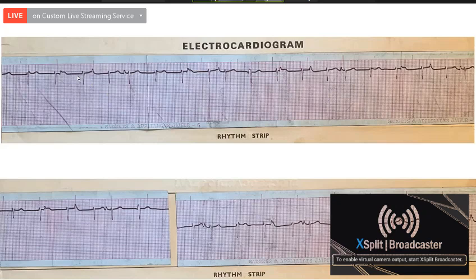The junctional rate is 80, 82. Is it the normal junctional rate or is it a faster rate? Faster, sir. Accelerated junctional. Yes, more than 60 is a faster rate. So it is a junctional tachycardia. Yes, sir. But the rate is only 80. For us to call it a tachycardia, very often we expect the rate to be more than 100.